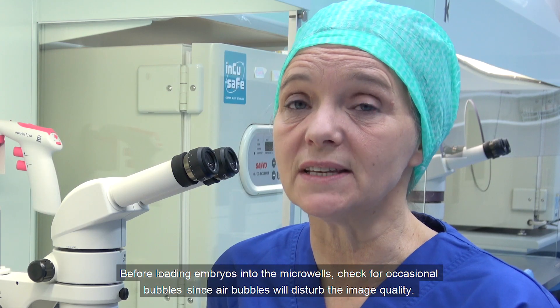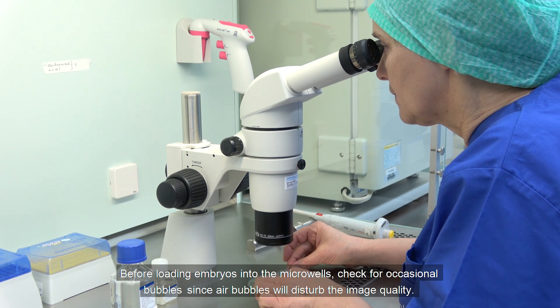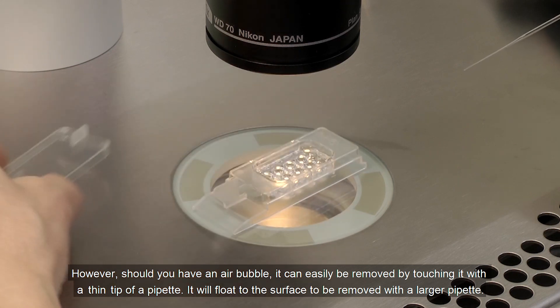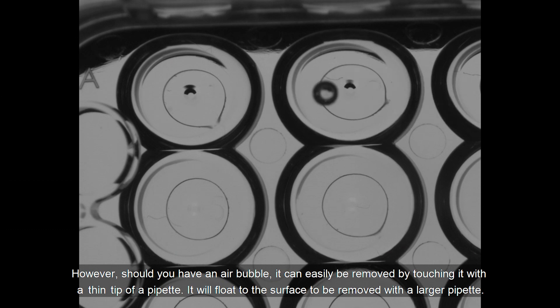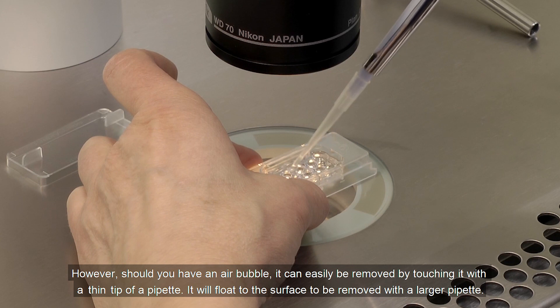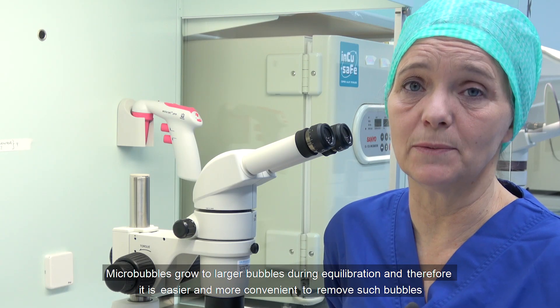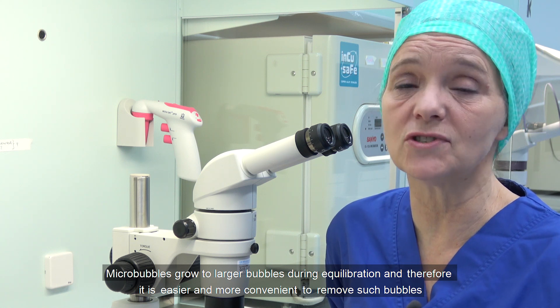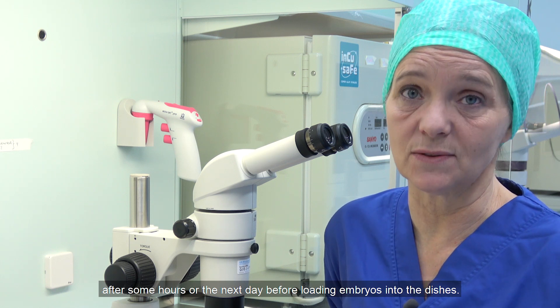Before loading embryos into the microwells, check for occasional bubbles, since air bubbles will disturb image quality. Should you have an air bubble, it can easily be removed by touching with a thin tip of a pipet and it will float to the surface to be removed with a larger pipet. Micro bubbles grow to larger bubbles during equilibration. Therefore, it is easier and more convenient to remove such bubbles after some hours or the next day before loading embryos into the dishes.